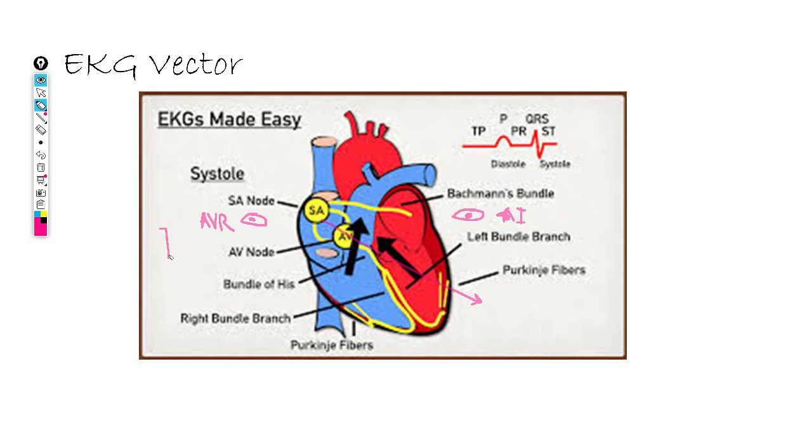It will go up and go down, the QRS complex. This is negative deflection because it's moving away, and this is positive deflection because it's moving towards, relatively speaking. Now let me expand on this concept.